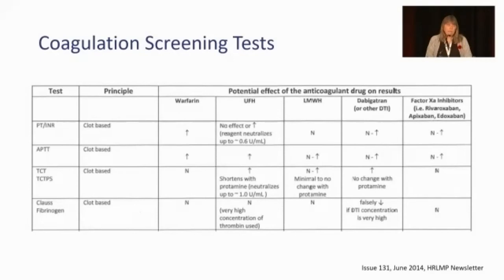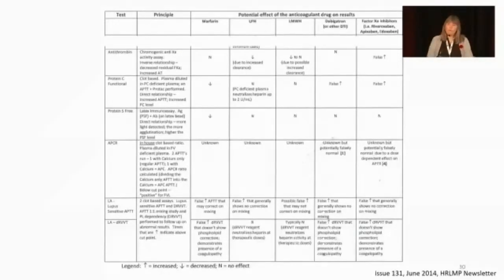We went a step farther, and we also did this for our common special coag testing, our thrombophilia workups. Because again, even though thrombophilia lab testing is not recommended, and I'm not suggesting you send it, we do still receive a lot of investigations.